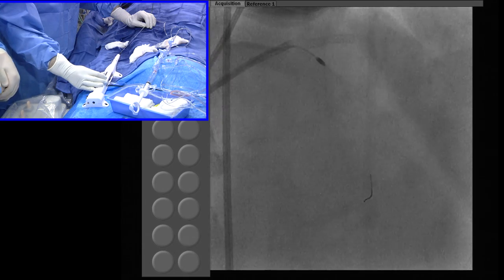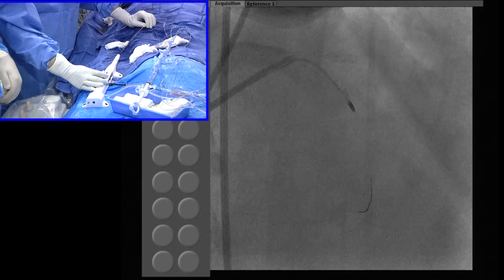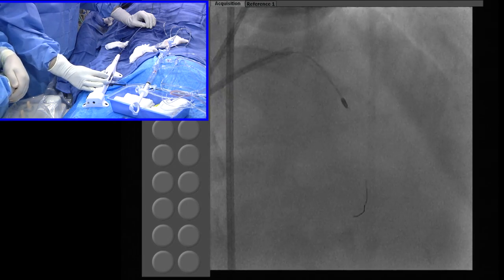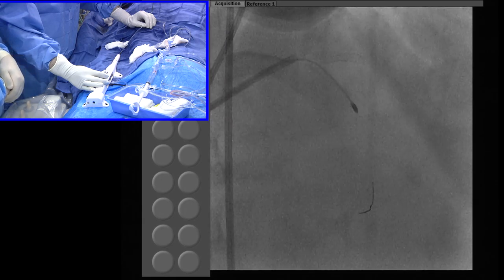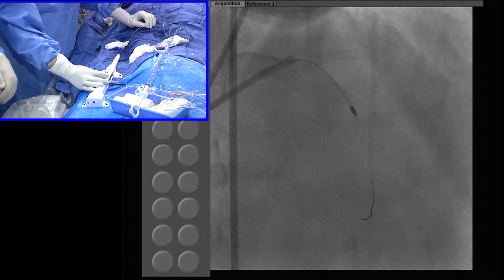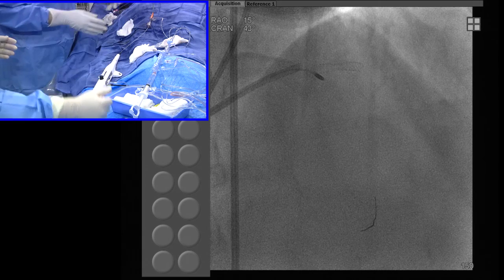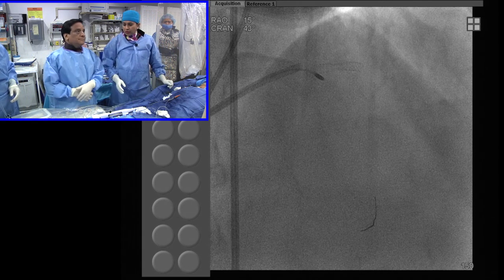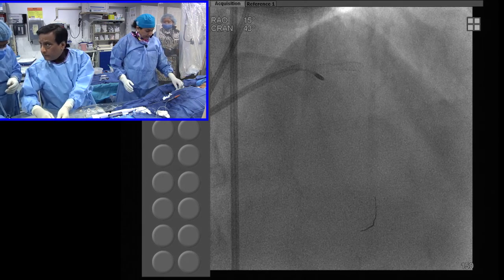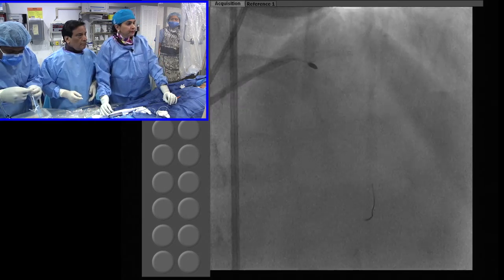Last month we had Dr. Chuck Simonton join us, and the salient message he seemed to be giving us is that you need to prepare the lesion, image it, and then post-expand. I don't know how much patience everybody has; everyone will have to do this much work. I think lesion preparation is going to facilitate deployment of the stent considerably.